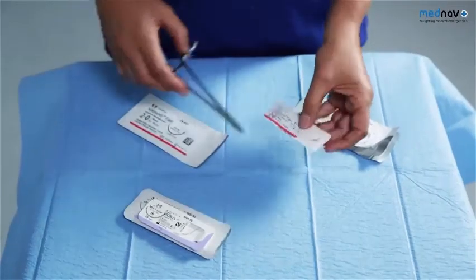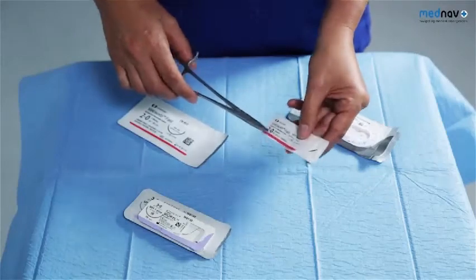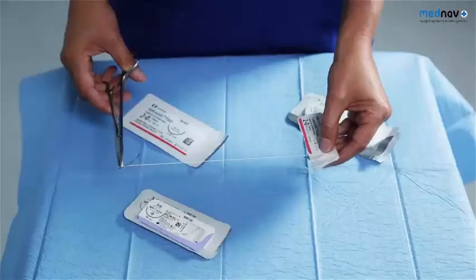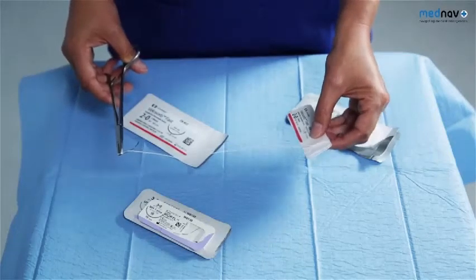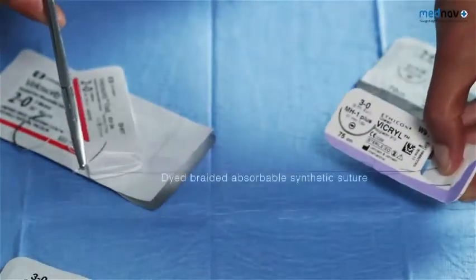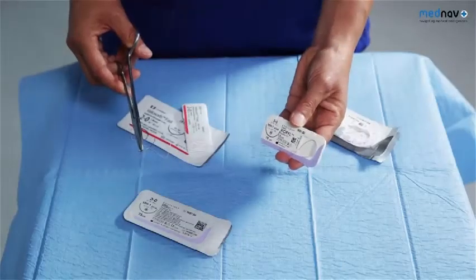You'll need some sutures. A rapidly absorbing 2-O suture, such as a Vicryl Rapide, will be used to repair the vaginal skin, the perineal muscles, and the perineal skin. This has been shown to be preferable as it reduces wound dehiscence, pain, and the need for the suture to be removed up to three months post-delivery. Fine sutures, such as 3-O Vicryl, are used for the anal mucosa, and are preferred over cat gut for their tensile strength, non-allergic properties, and lower infection rates.